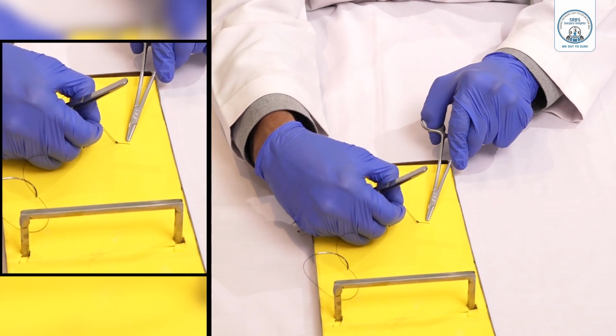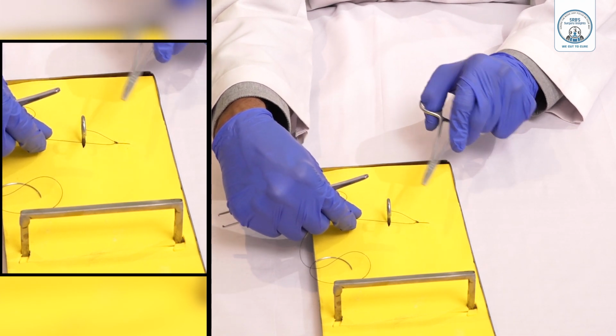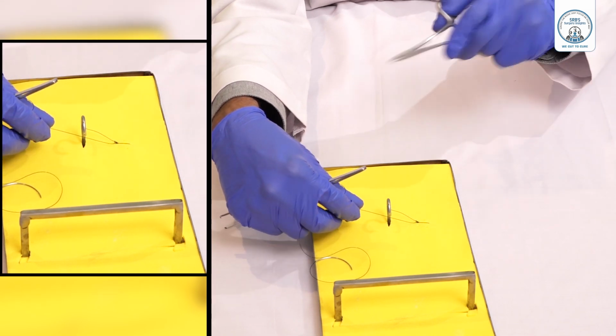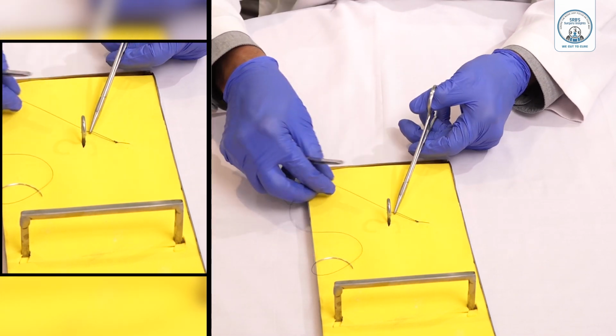See that the wound is here and the knot has come to one side. I have put a reef knot. So 3 half knots or 3 throws should be there: one from the front, second from behind, third from the front. That is the reef knot that I am going to explain later. So this is a simple interrupted suture.